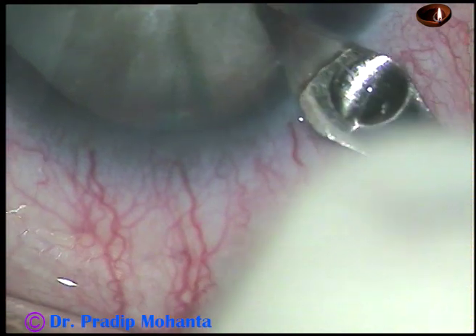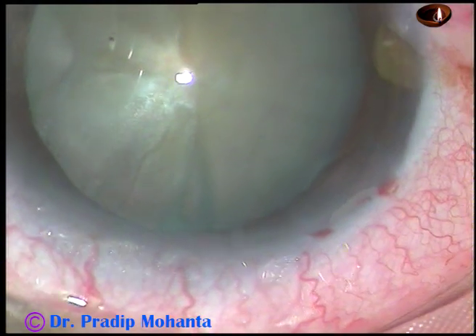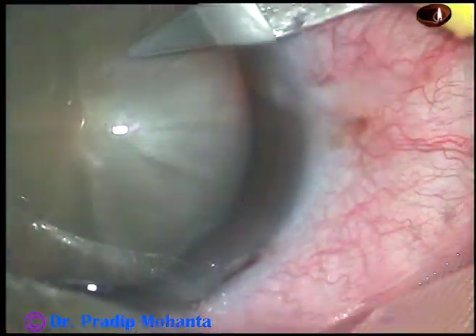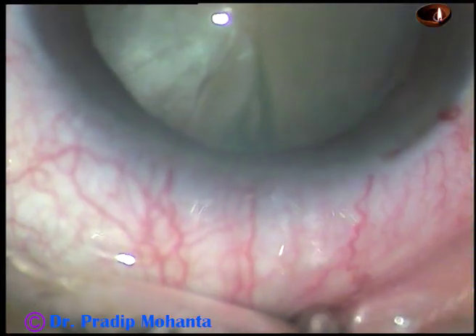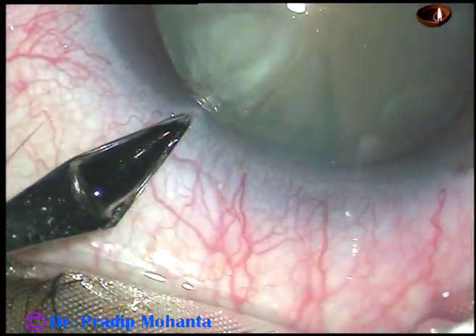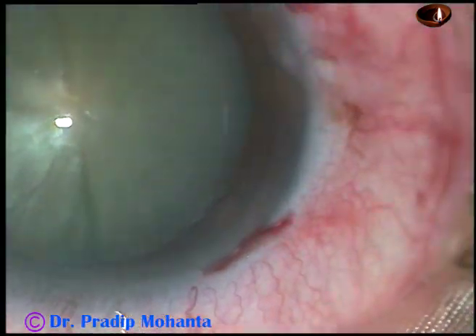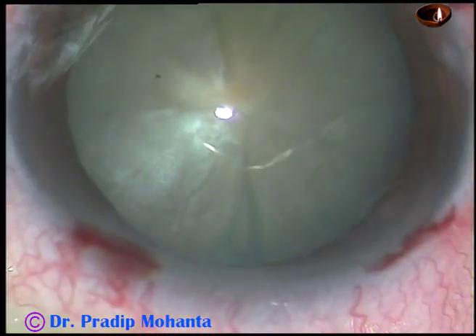This is the main incision on the posterior aspect of the limbus with a 2.8 millimeter cataract knife. Now this is a side port on the right side and this is another side port on the left side. The side ports are about two to two and a half clock hours away from the main incision.